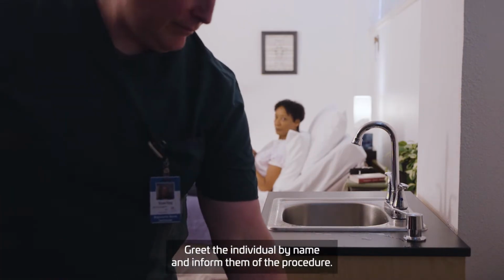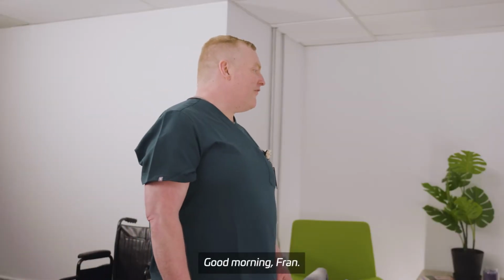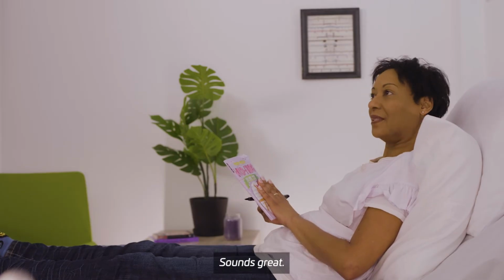Greet the individual by name and inform them of the procedure. Good morning, Fran. Hi. My name is Brian. I'm going to be your care provider today. Okay. We're going to get you up and walk you to your wheelchair so you're ready for your appointment. Does that sound good? Sounds great.